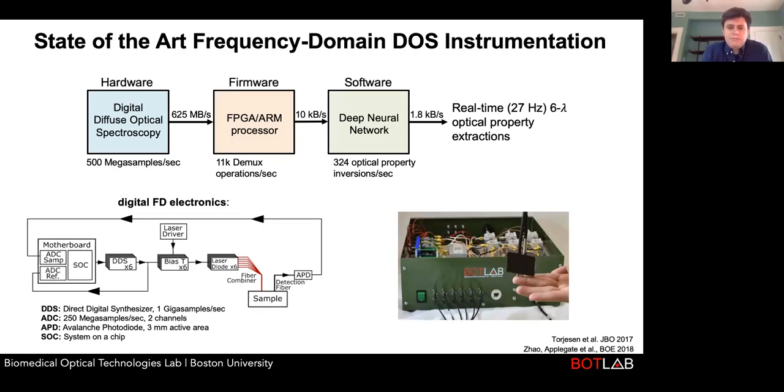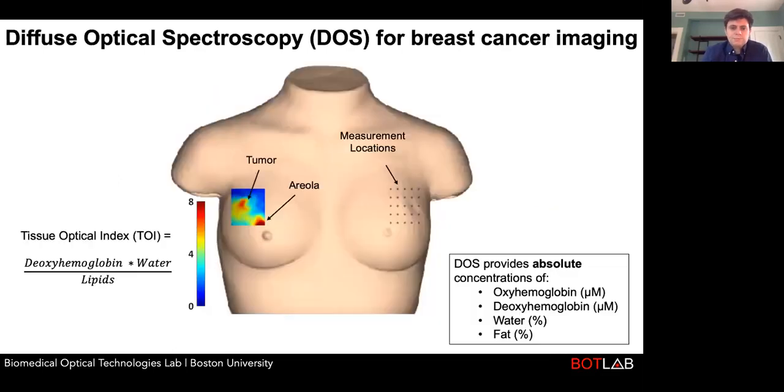Yes, thank you. So we've done both. And you can see our source detector and fiber here on a finger. This is reflectance geometry. And in the breast, we do reflectance geometry. So the source and detector fiber for breast measurements tends to be 28 millimeters of source detector separation in reflectance mode. Okay, thank you so much. Yeah, no problem. And that's the data I'll be showing you, but just for context, other groups use even transmission through the breast in some cases. But we're reflectance for this.